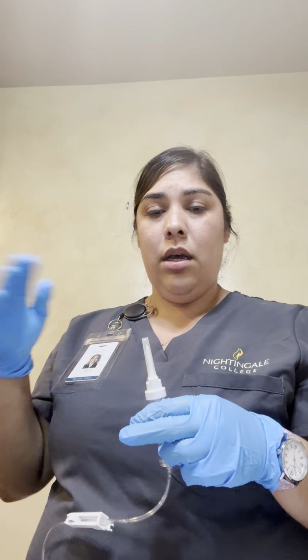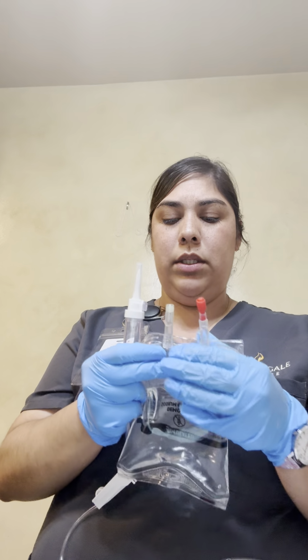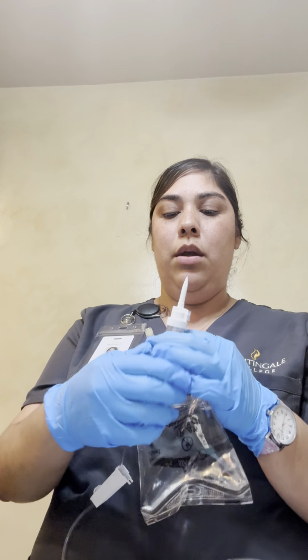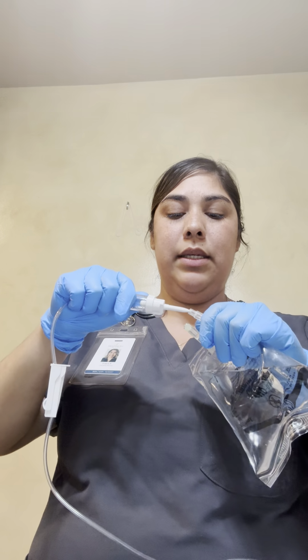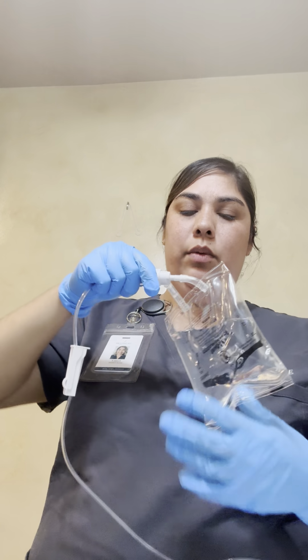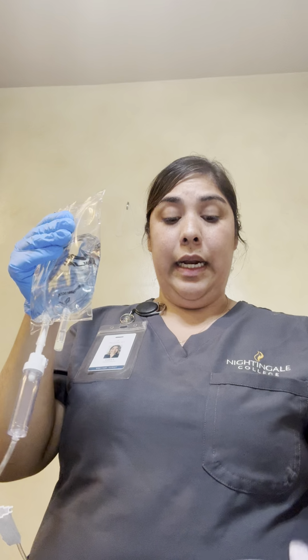I have a cup here just to collect the fluid as we start priming our bag. We want to make sure that we're keeping these sites sterile, so I don't want to puncture, open anything, or use anything until I'm ready to go, which now I'm ready. I'm going to spike this bag, which means it's just going to go straight in there. We can twist a little bit to make it easier. I'm going to hang it up before I prime it.